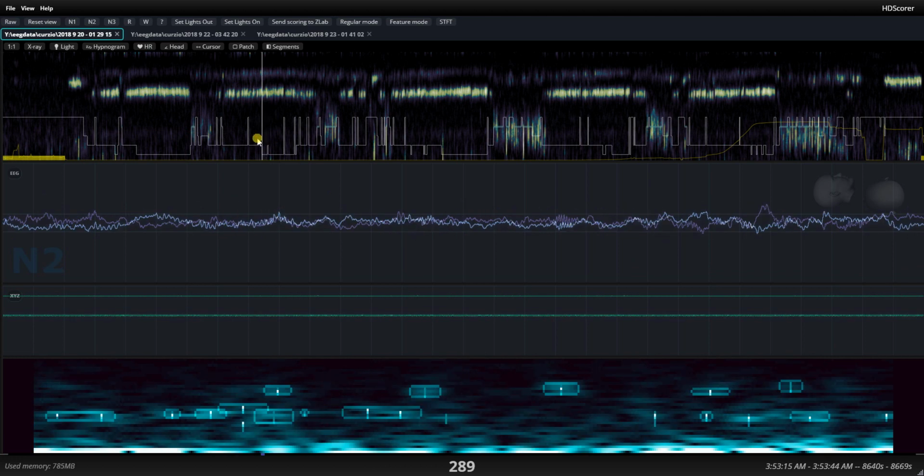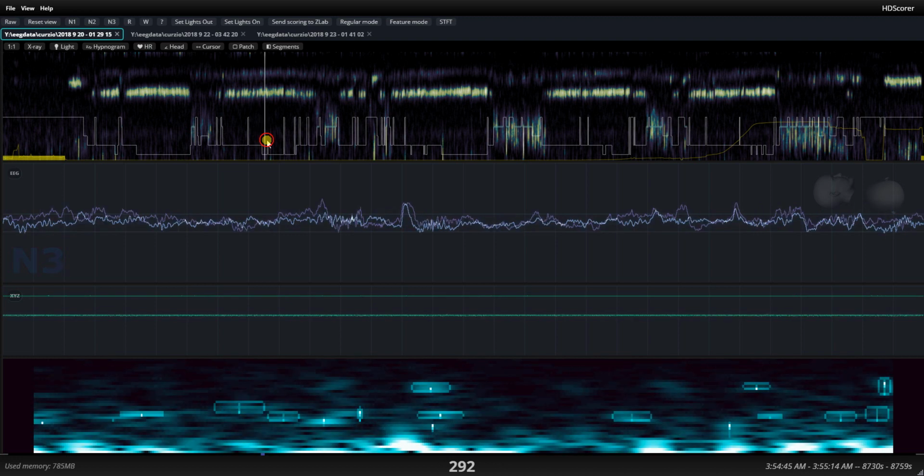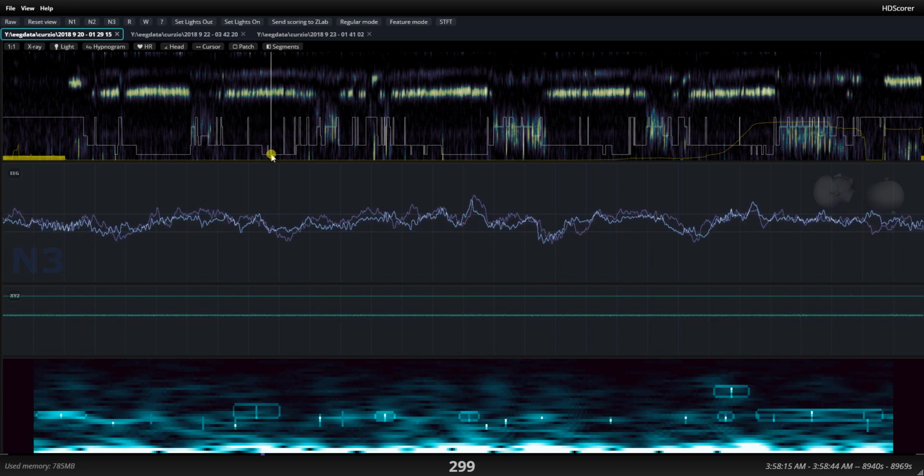But the idea is not that this particular descent on the hypnogram has to be in the exact perfect epoch. The important thing is you move 5-6 epochs to the left and it's got to look like N2, and then you move 5-6 epochs to the right and it's got to look like N3. And remember that this could be a very slow descent.